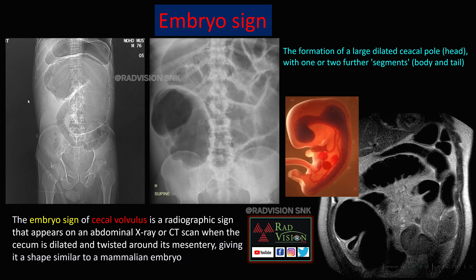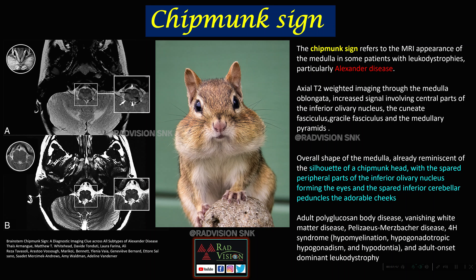Next is the Embryo Sign. Here you can see a dilated cecal loop — this is a dilated cecum with twisted mesentery, typically seen on abdominal radiographs in a case of cecal volvulus. The large dilated cecal pole mimics the head of the embryo, and the other segments mimic the body and tail of the embryo. The Embryo Sign is classically seen on abdominal radiographs in cecal volvulus. It can also be seen on MR imaging, which also typically shows cecal volvulus.